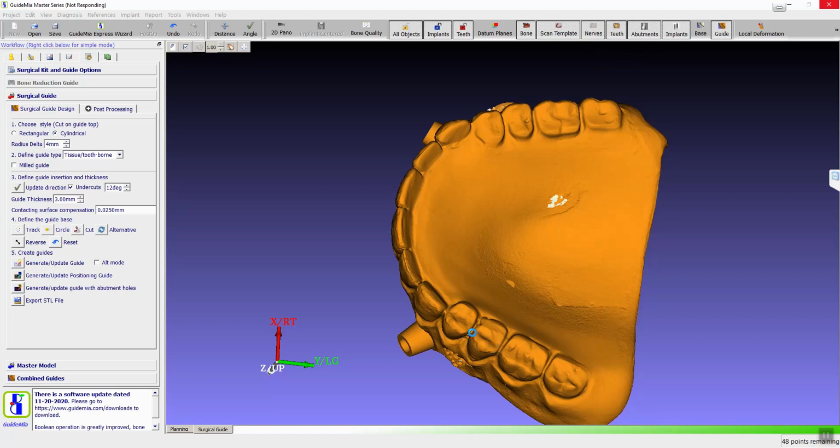Make sure it fits well. If you need to grind, you grind it. Then you take it out, grind away the anchor pins, and then you have a restoration. I mean, it's not quite as sexy as Chrome, but it would do the job.